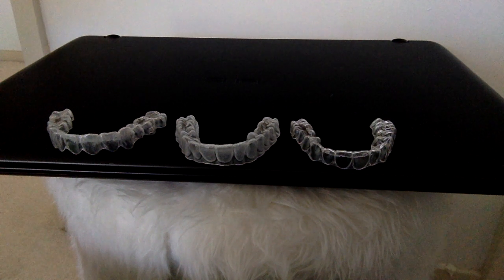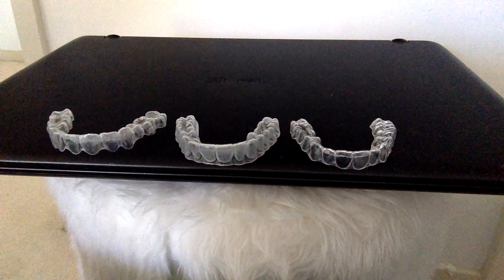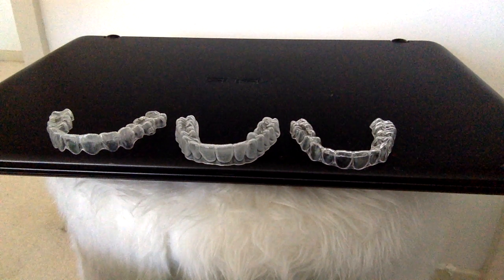StraightSmile Solutions, and today we're going to be talking about what is the difference between the different kinds of aligners that are out there. Here we've got Invisalign, we've got ClearCorrect, and we have a 3D printed aligner you can make in-house. So just some examples of what's out there. I think a lot of times it's hard to compare apples to apples. Of course, the treatment plans make a difference.